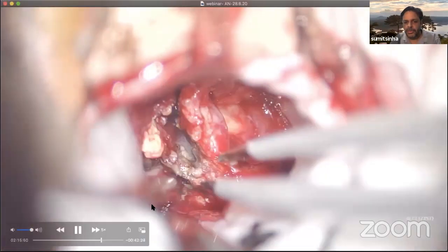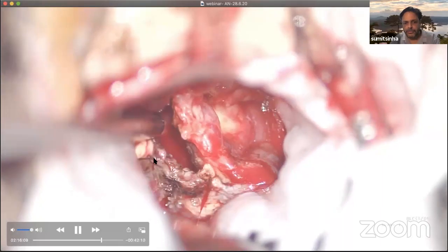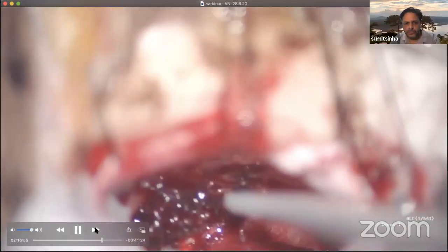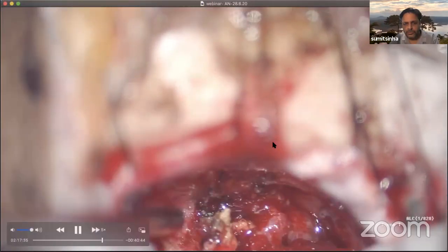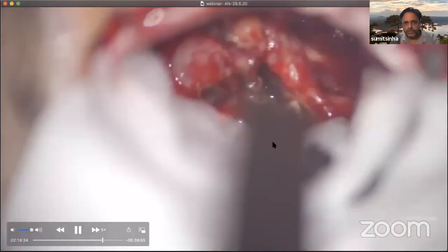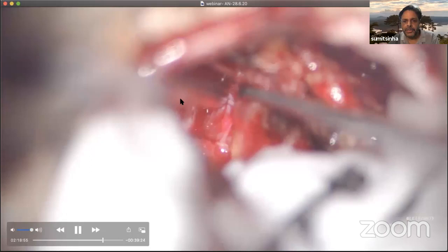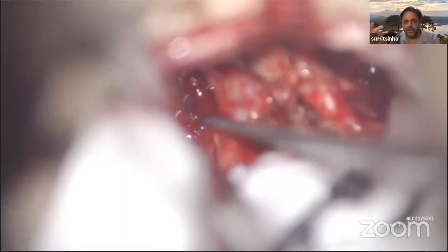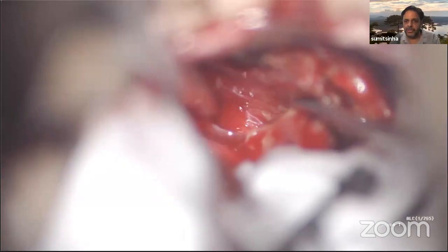Now separating the medial part from the brainstem. Separating the superior pole of the tumor. See the arachnoid there? Acoustic surgery is a play of arachnoid membranes. It's an arachnoid surgery. Like meningioma surgery is an arachnoidal surgery, acoustic tumor surgery is an arachnoidal surgery. And you do this surgery beautifully when you pay respect to the arachnoid membranes. They have to be very thankfully respected during these two surgeries.